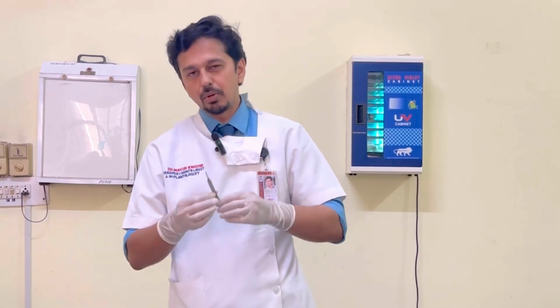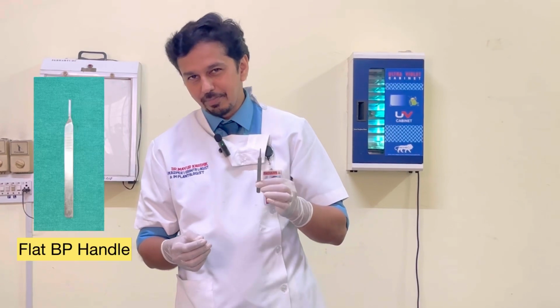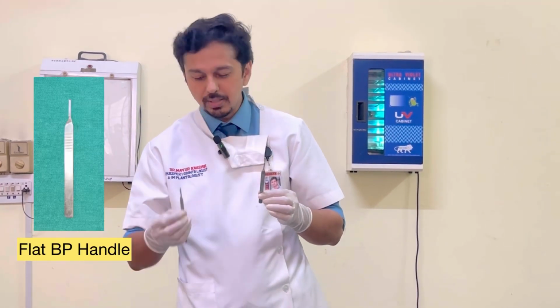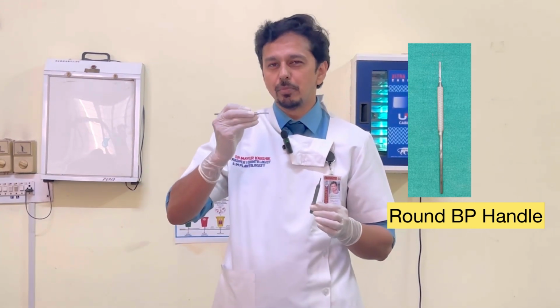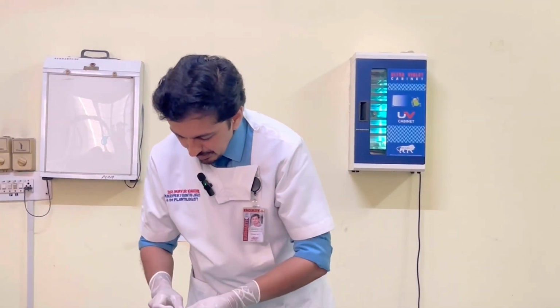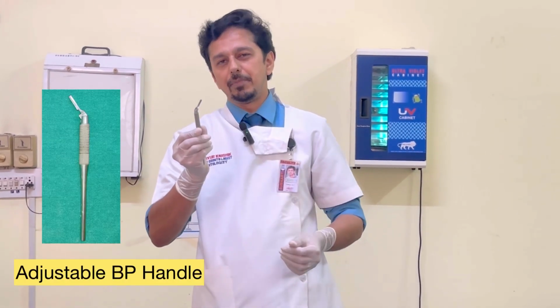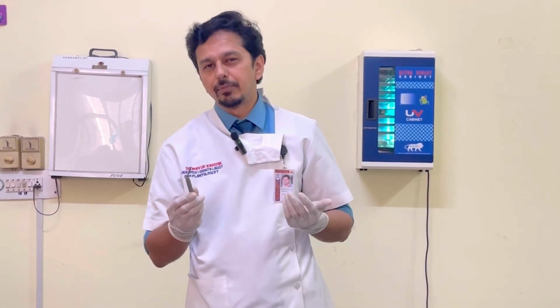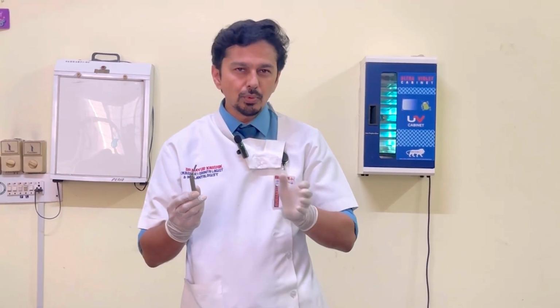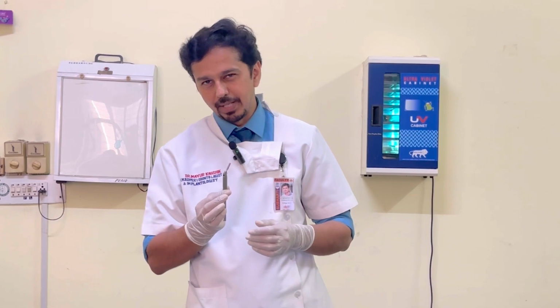Now in number 3 also, from a surgery point of view, we might be using a plain flat BP handle. We might end up using a round BP handle. I personally prefer a round BP handle because it is easy to manipulate. And finally, in round also, we have something known as an adjustable BP handle for areas which we cannot access directly. Maybe if I am placing an implant in the 6th area and I have to raise a flap, distal to 5, I'll find it more convenient to use an angulated BP handle.